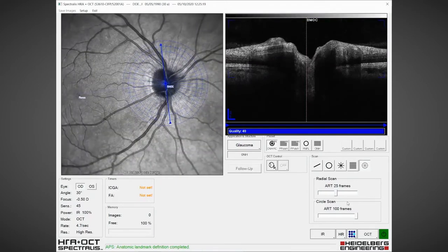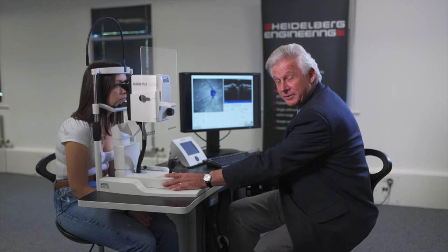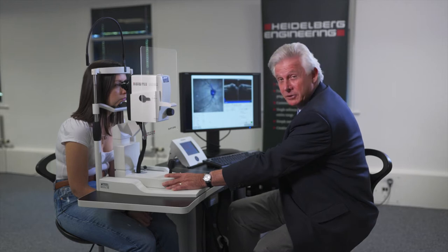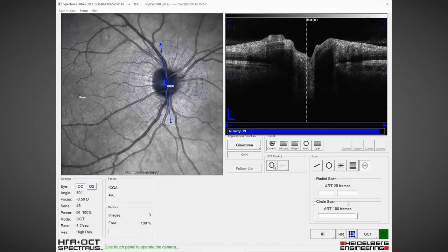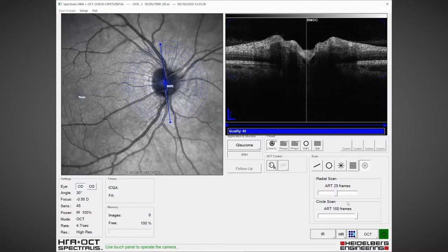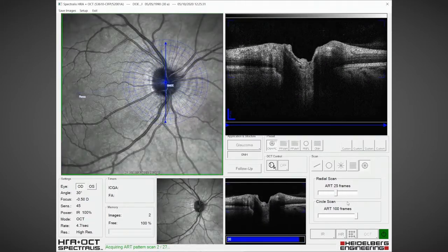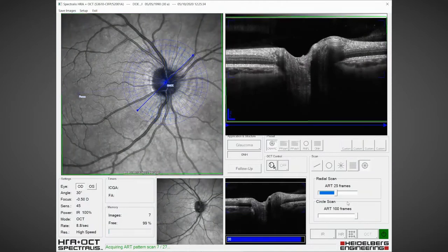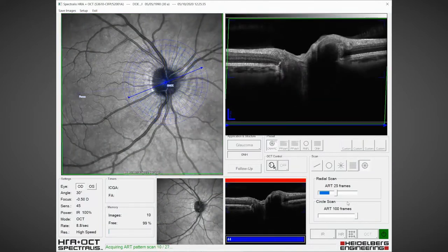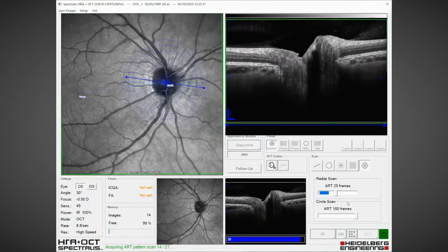We fix the axis of the fovea to the optic nerve centre for each individual eye. Now we can start scanning — I'm going to press acquire and we're going to do 24 radial scans of the optic nerve head and identify 48 locations of Bruch's membrane opening.